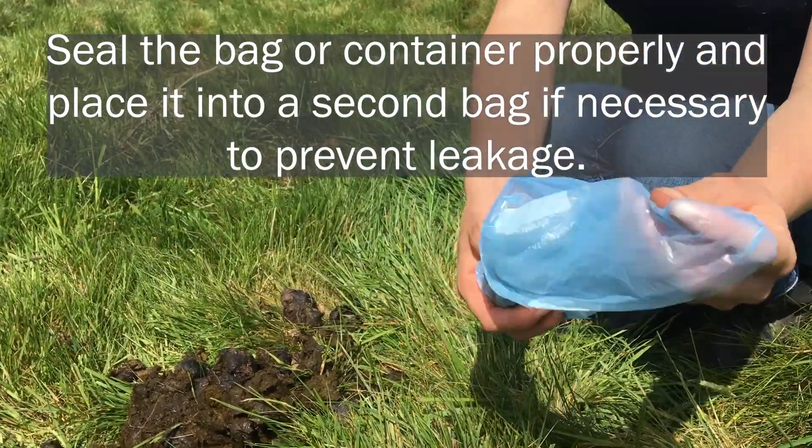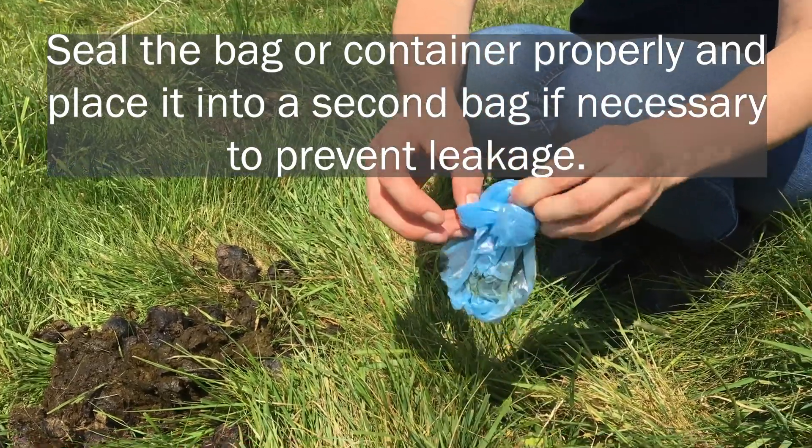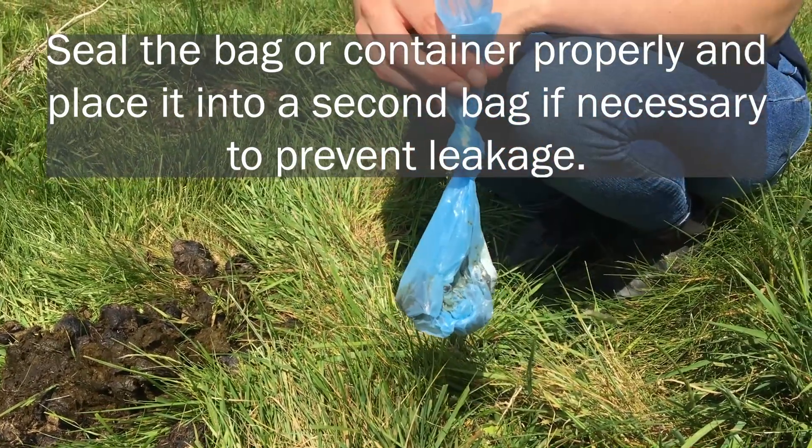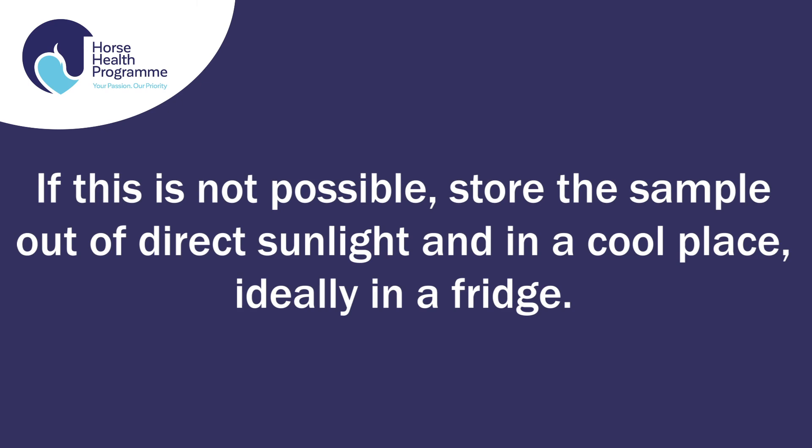Seal the bag or container properly and place it into a second bag if necessary to prevent leakage. Try to deliver the sample to your vet or post it to the lab on the same day that you collect it. If this is not possible, store the sample out of direct sunlight and in a cool place, ideally in a fridge.